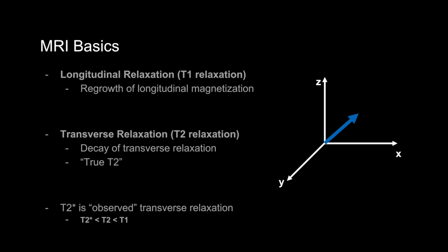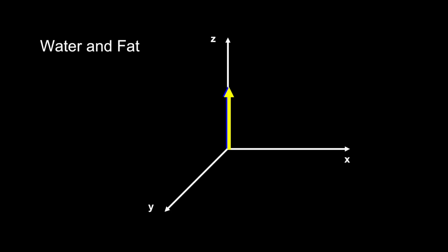Just stick it out. We'll get to more clinically relevant things relatively shortly. If you take one thing away from the last few slides, it should be this. Any given tissue has a particular T1 relaxation time, namely how fast it recovers magnetization in the z-axis, and a T2 relaxation time, how long it takes for transverse signal to decay. And we can differentiate tissues based on this, which is the whole point of imaging.